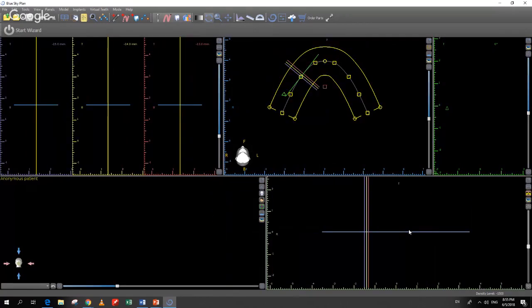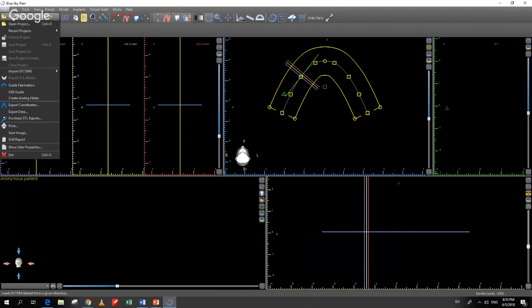Now we have Blue Sky Plan open. Let's load a CT scan, which will help explain the screen layout. To start a new case, go to File > New Project. 'New Project' loads a new DICOM set for a new patient; 'Open Project' opens a previously saved Blue Sky Plan file. Blue Sky Plan creates a file that contains all the DICOM data and all the planning connected to it, so in the future you just double-click that one file to reopen the case.